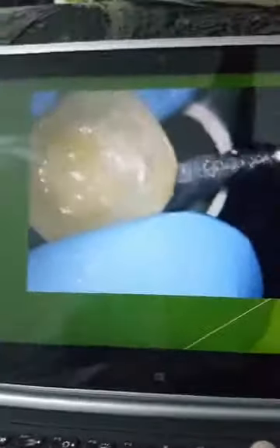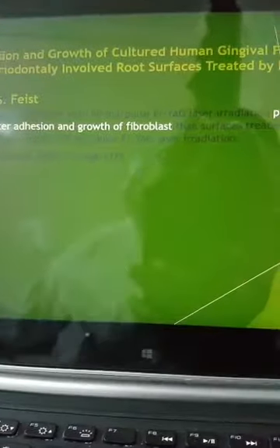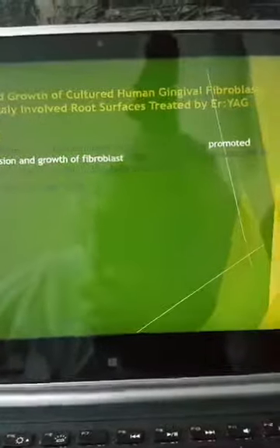So you need to apply laser on all surfaces. Okay, this is enough. Again, using laser is very important also for the soft tissue. I think laser has also an important role in that.